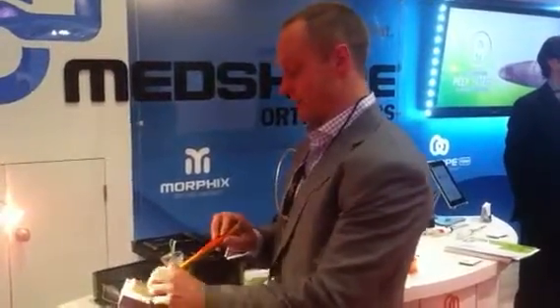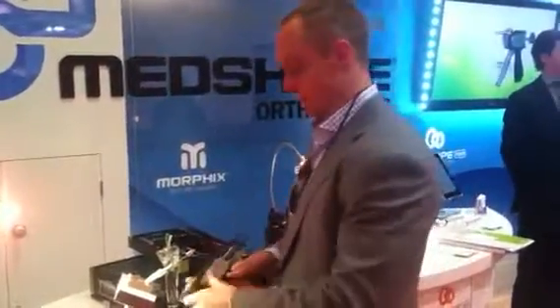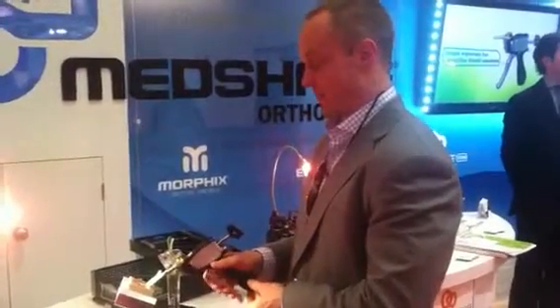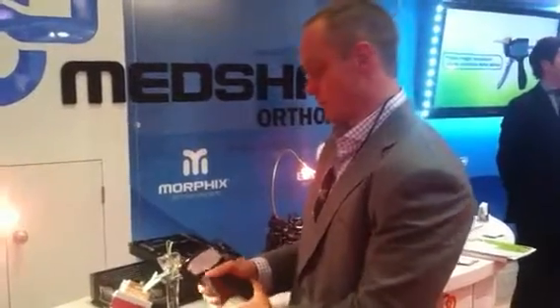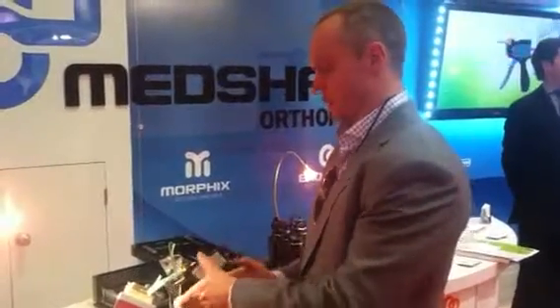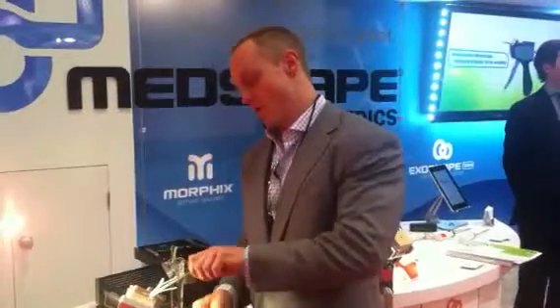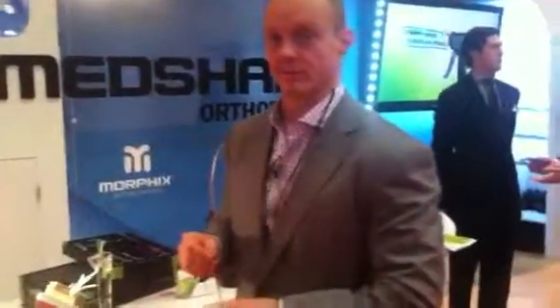Then pull the insertion tool off. Take the gun, put that on, and deploy the implant. T-bar. That's it.